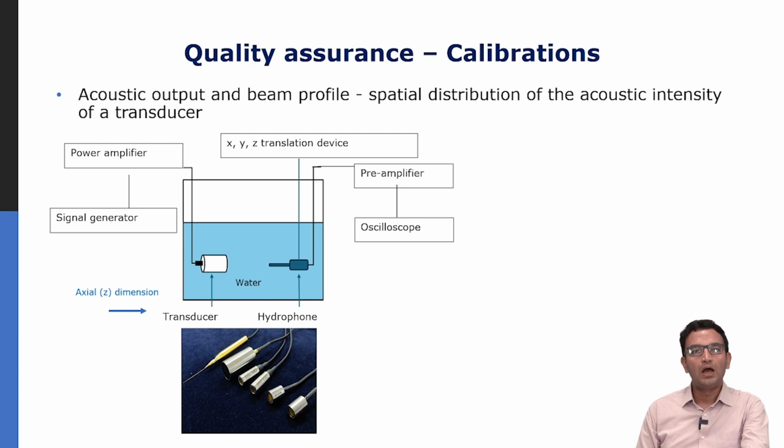Now, in terms of quality assurance for my system, I can do a few things. For example, we can get a system calibrated consistently to make sure that the outputs coming out of the system are consistent, to make sure that if we have transducer arrays, none of the transducer elements are low in sensitivity relative to the other elements.